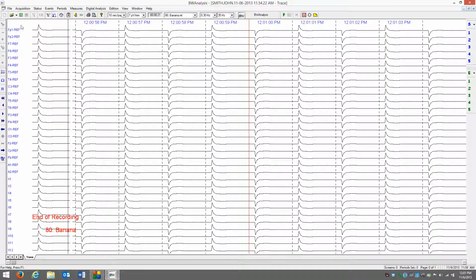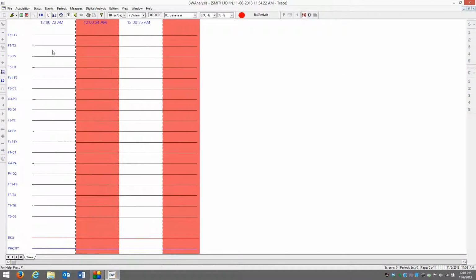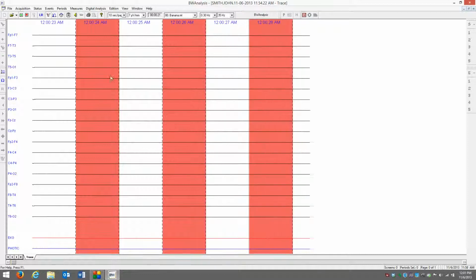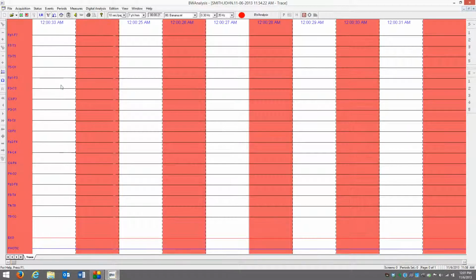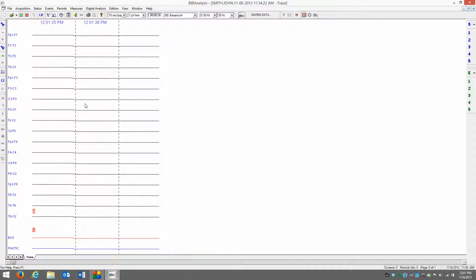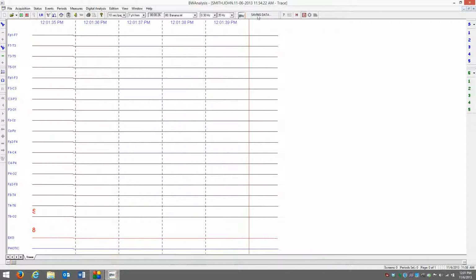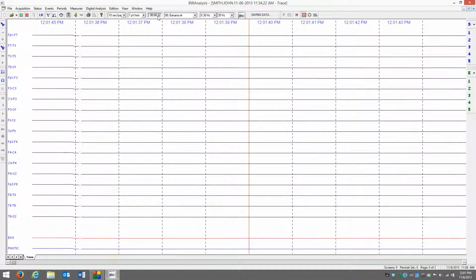If you want to get started, we click on the start and finish button, basically our play button, and this will automatically take us into not recording mode. So we can see it's flashing and we can see the intervals of white and pink. This signifies that we're not recording. Okay. In order to initiate the recording, we click on the record button. Once you click record button, it goes away, everything goes white. We are now saving data and our recording timer is now ticking. Okay, so we're recording data. At this point, we don't have anything hooked up, so we're just picking up flat lines.